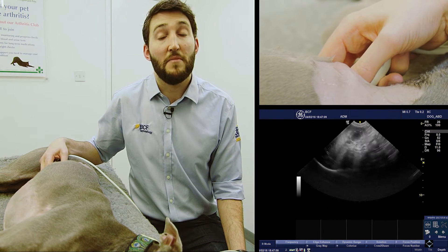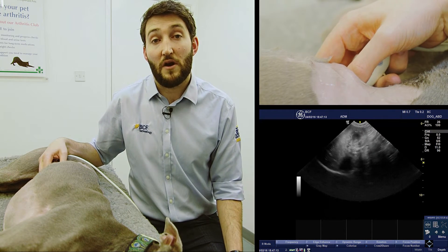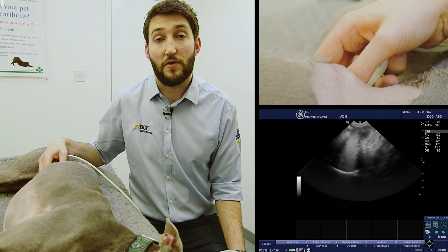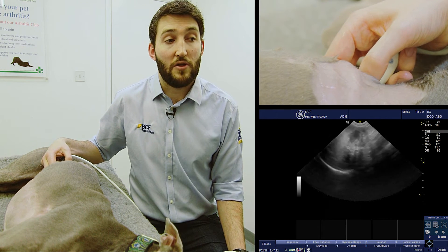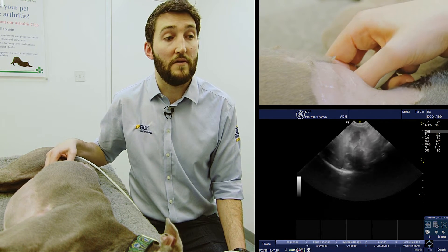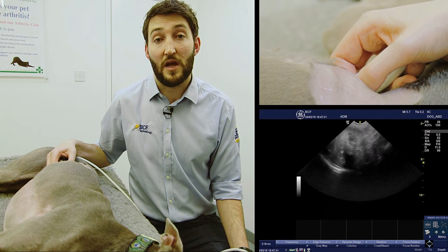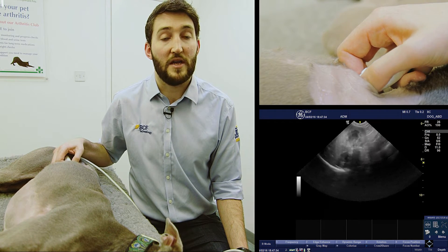First of all, find the right kidney in much the same fashion as you would find the left. Just bear in mind that the right kidney tends to hide a little bit more cranially than the left, and so many dogs will be subcostal, so you may have to use an intercostal approach. In this dog, Ash, I am actually able to image his right kidney in dorsal plane by using a subcostal approach, and if you can, you may find that a little easier because you don't get rib shadowing.